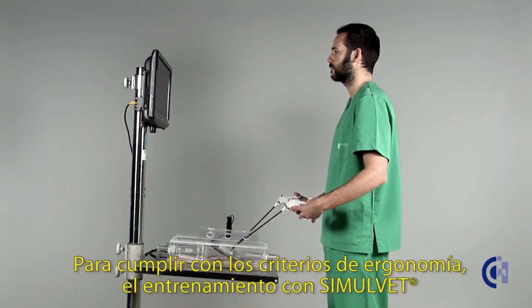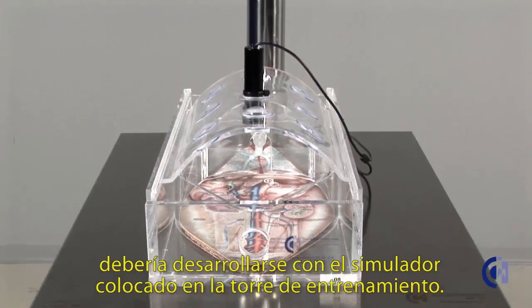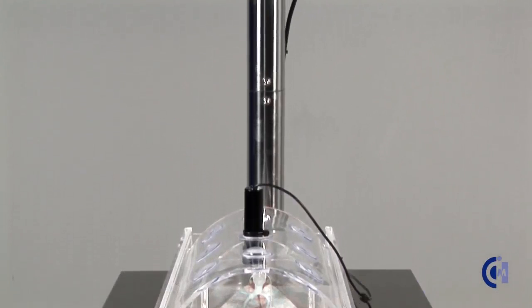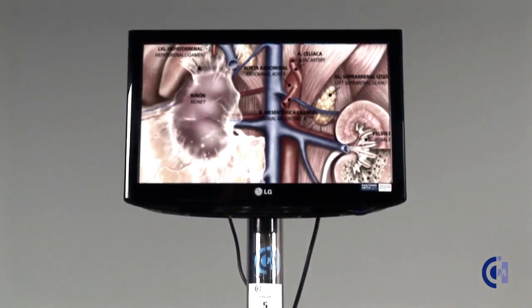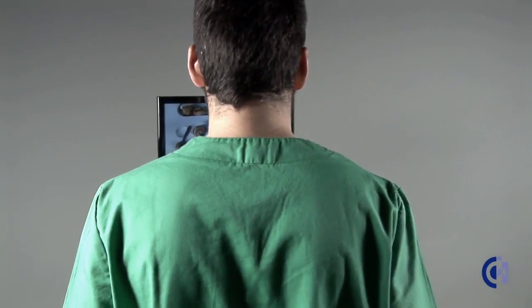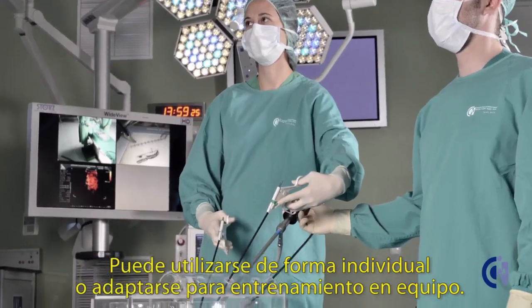To meet ergonomic criteria, training on SimulVet should be performed with the simulator placed on the training cart. It can be used individually or adapted for team training.